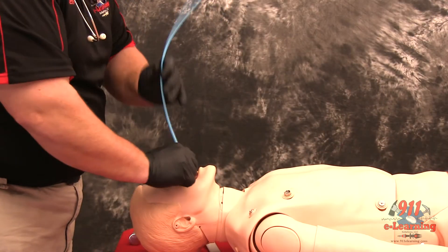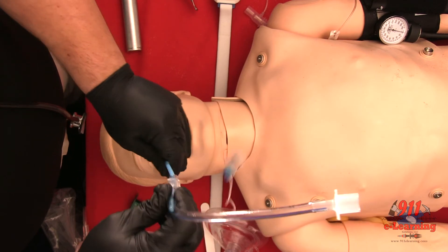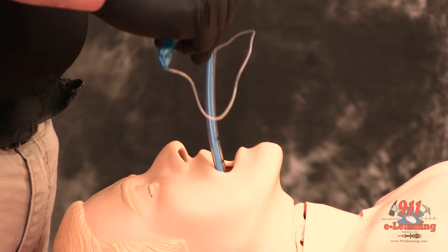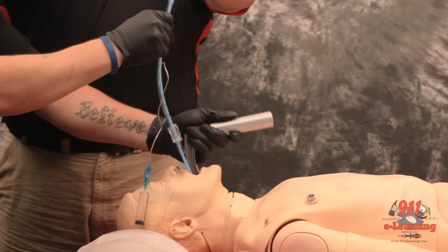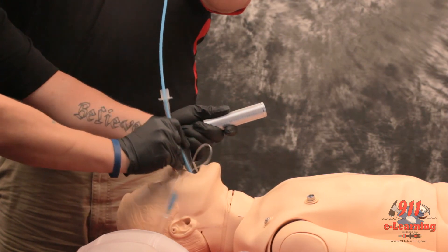Withdraw the bougie only to a depth sufficient to allow loading of the ETT while maintaining proximal control of the bougie. While maintaining a firm grasp on the proximal bougie, introduce the ET tube over the bougie, passing the tube to its appropriate depth. If you are unable to advance the ETT into the trachea and the bougie and ETT are adequately lubricated, you may attempt direct laryngoscopy while advancing the ETT. This will require an assistant to maintain the position of the bougie and, if so desired, advance the ETT.